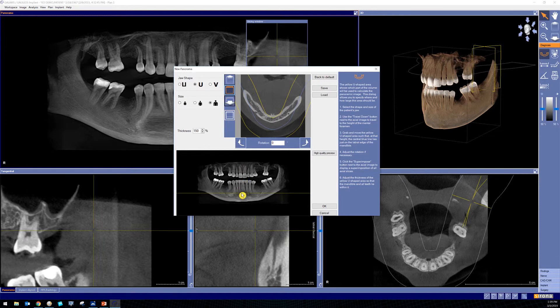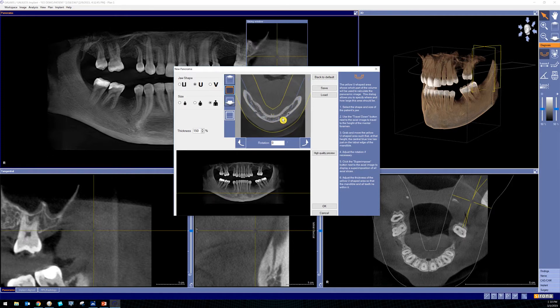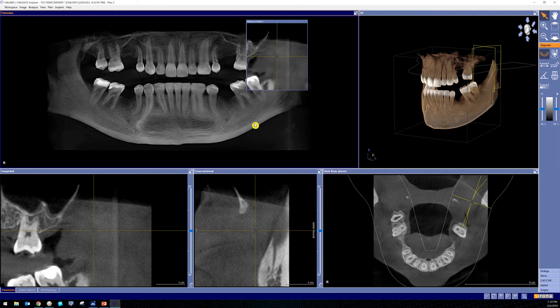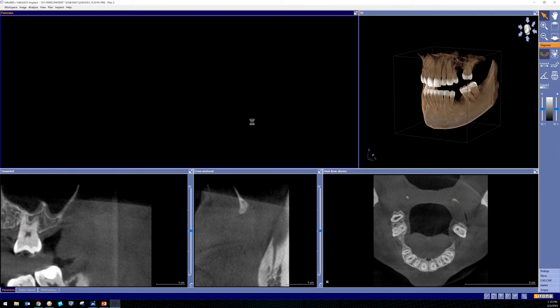After I've been able to dissect the mental foramens, I will go up to this axial view, click and hold the blue line, and then move that up to dissect the bone as best as I possibly can. I'm going to release, and at any time, if you need additional instruction, notice they are here on the right-hand side. If I like the way that looks, I'm going to click OK, and then watch how this image is now going to change.